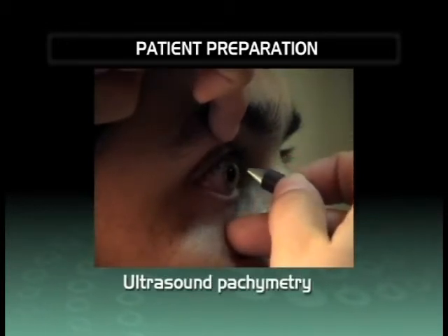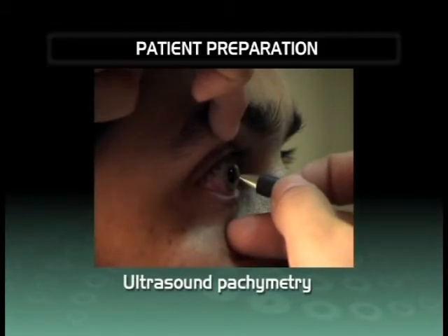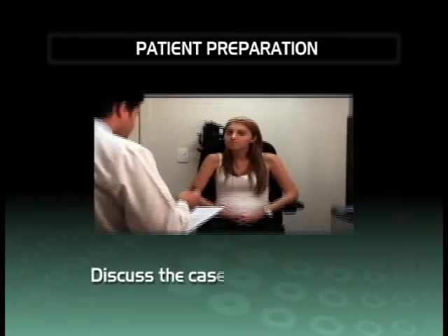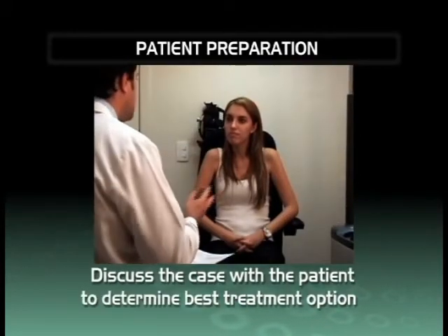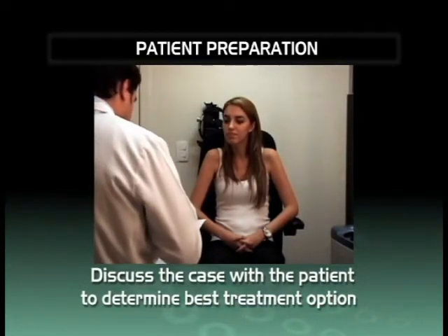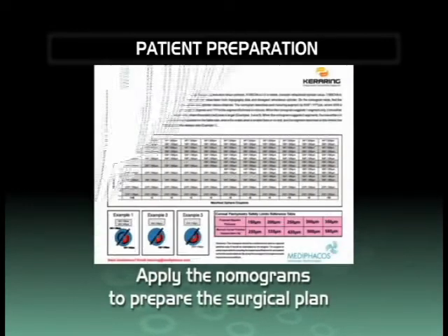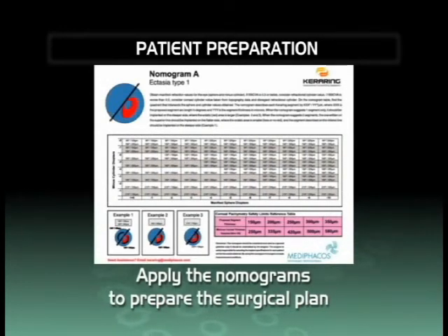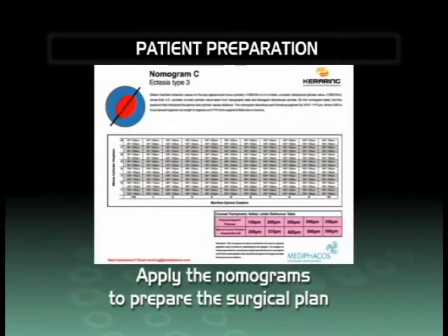Careful pachymetry readings should be taken and recorded. Measure the corneal thickness all around a 5 mm optical zone. It is important to discuss with the patient about his condition and treatment options, including Keraring implantation. Use the nomograms provided as a guideline to select correct Keraring size and position for each case.